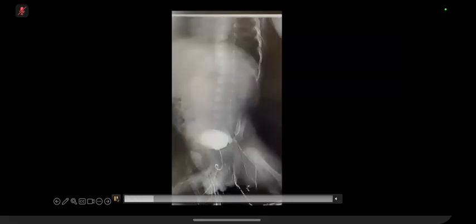Okay, very good. There is one additional finding which I want you to pick up. Okay, I will play the video once more. I think that there was a diverticulum outpouching near the vesicoureteric junction. Yes. Yeah.